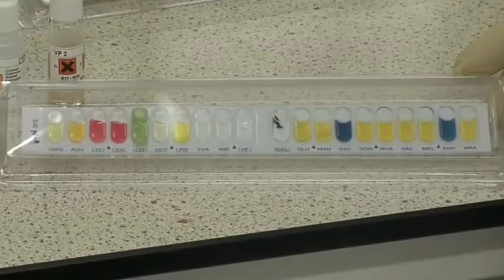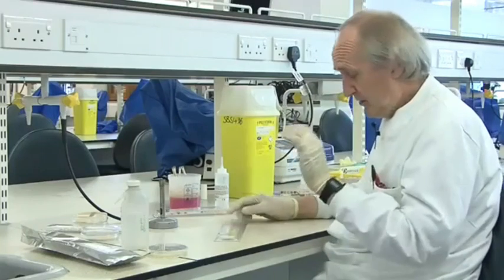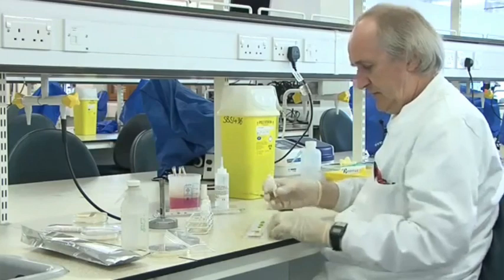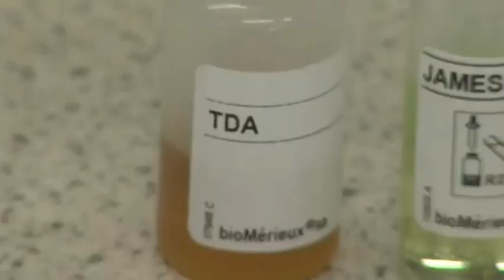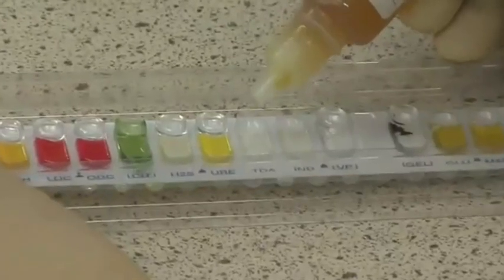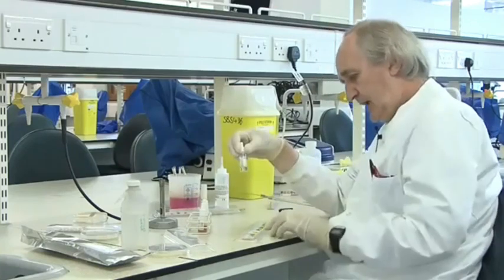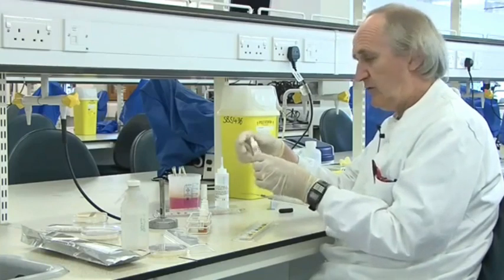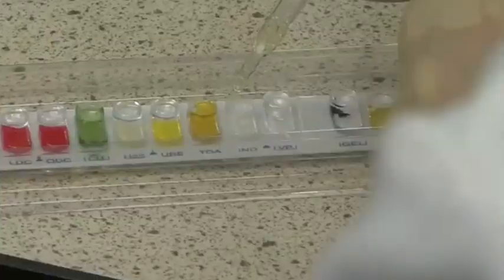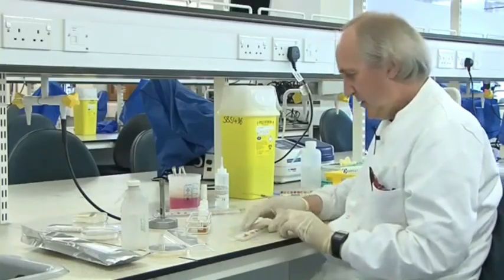Here are a couple of strips — this is organism one, and this is a different organism I've called number two. Some of these you can just read the colour straight away, but with some compartments you have to add reagents, so that's what I'm going to do now. The first one in order is TDA, tryptophan deaminase. We've got some TDA reagent, which is ferric chloride, and we just add one drop to the compartment and let it run in. The next compartment is indole, and for that you add Kovacs reagent — or in this case I'm using one very similar called James reagent — again just one drop. It's already turned pink, but we'll discuss that later.